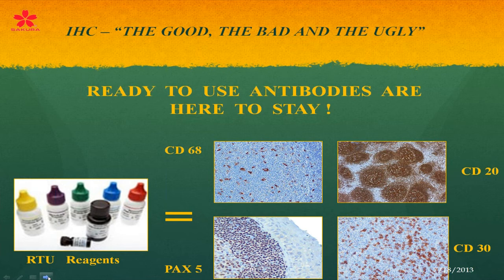But I do have to say, in our lab, we use ready-to-use antibodies, but we also use concentrates.